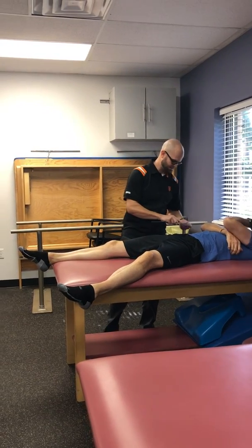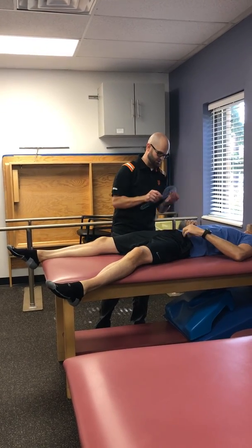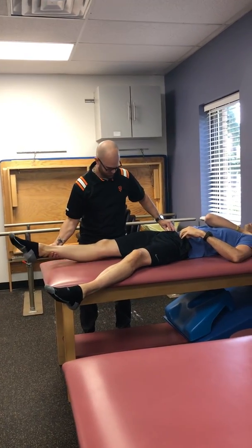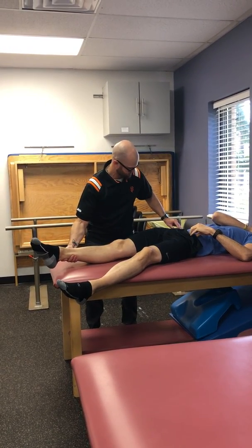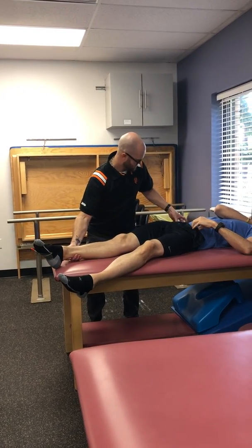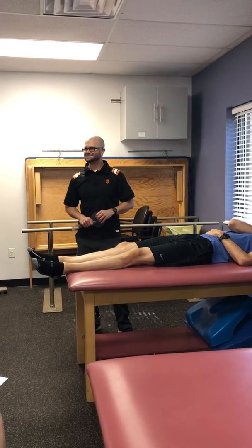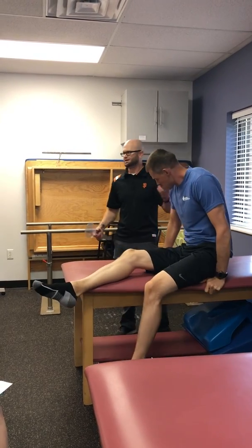So my points are going to be the exact same. ASIS for one fulcrum, ASIS for that proximal arm, down mid patella, and then I'm going to passively take him through. And again, when I start to feel that tightness, that end feel, or see his pelvis start to move just a little bit, just about right there. Pinch that, and ooh, 27 degrees. Okay, so he's got a little bit more than normal as far as adduction.